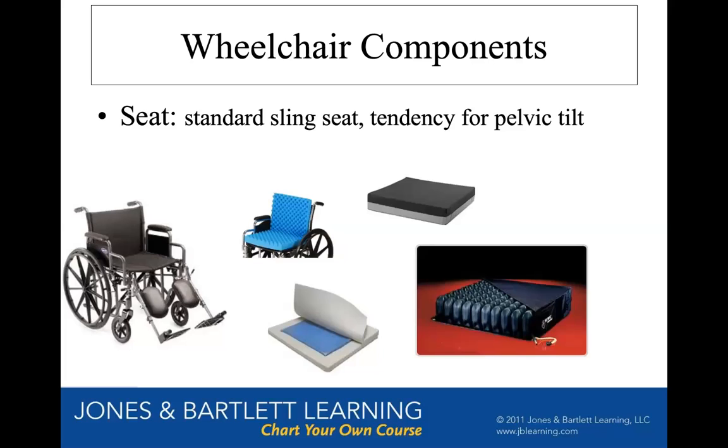You will think moving somebody out of a bed into a wheelchair, even if they're paralyzed, is easier than you think. But if they're truly paralyzed from the neck down, we usually use a mechanical or electric lift, like a sling that goes around their body, and it picks them up from the bed or from the chair, and lowers them down, and you can position them, like pick them up from the bed and then put them in the chair like that.